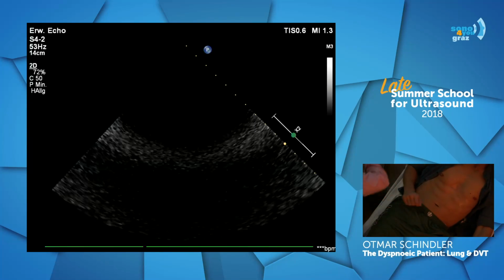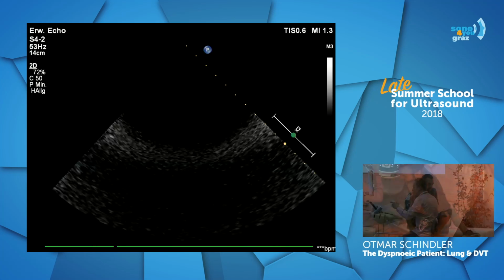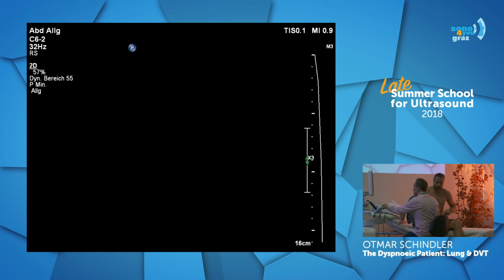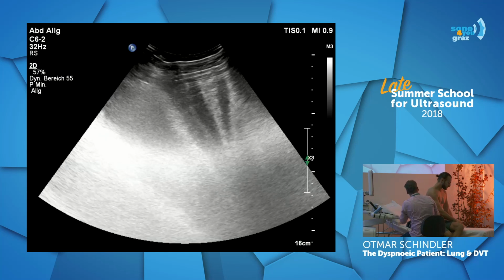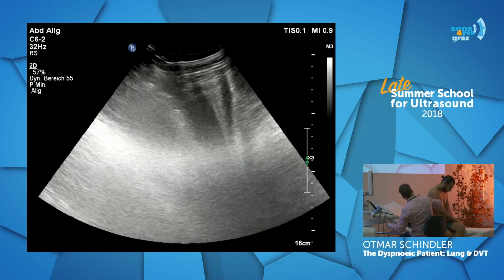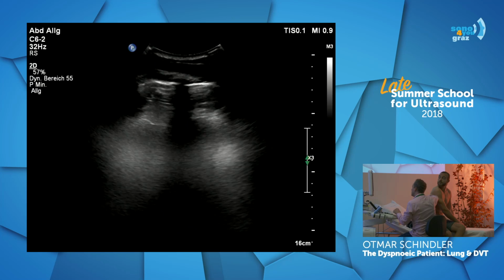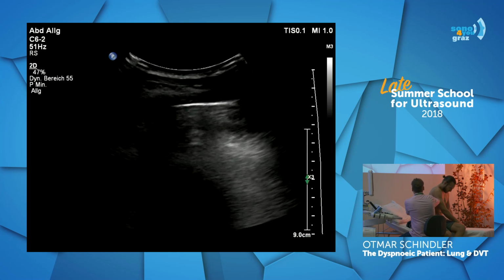And the third thing we could do, take the third probe. And we scan for subpleural defects.